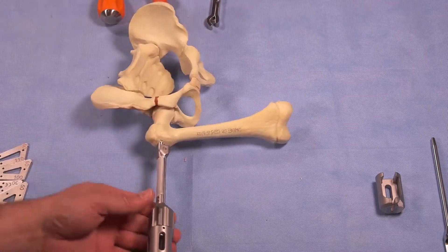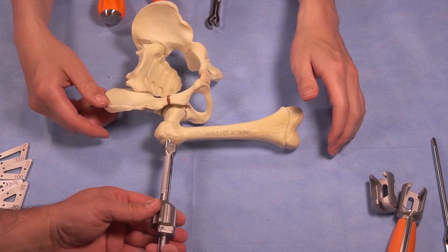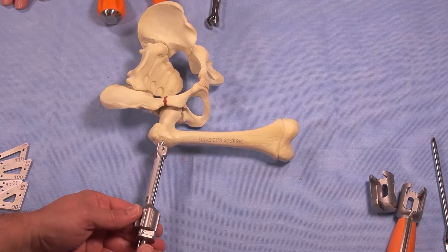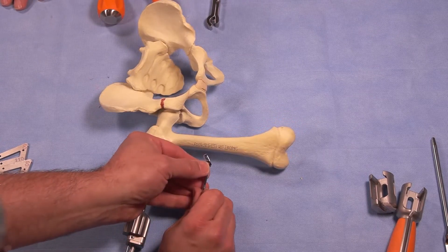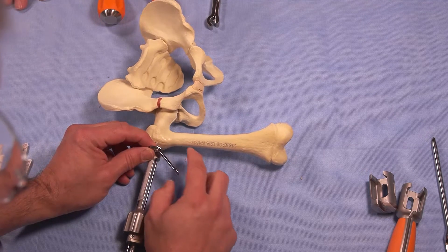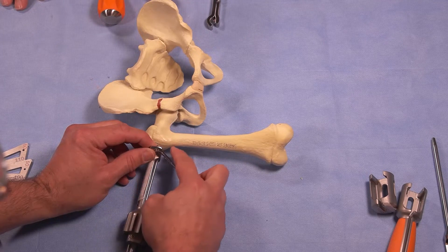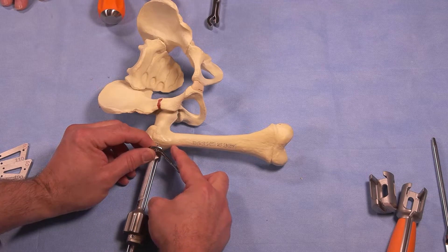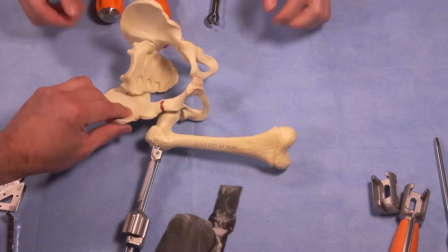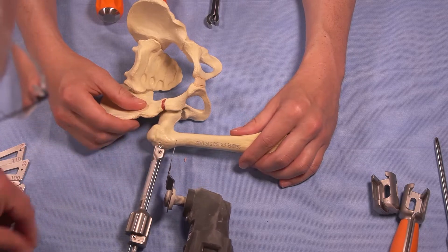At this point, I'm going to remove the handle. Now you're ready for your osteotomy. The osteotomy is determined by the width of the knuckle on the plate. The plate is going to be here, and I want to do my osteotomy just below this in a transverse fashion, allowing for good bone contact. This is a Wagner-type valgus osteotomy where a transverse osteotomy is performed and the lateral cortical angle is going to invaginate into the shaft of the distal fragment. I'll perform the osteotomy approximately three to five millimeters below where my knuckle would be.